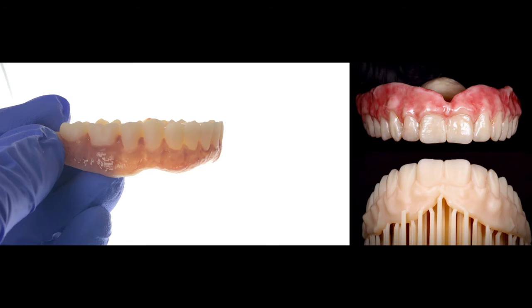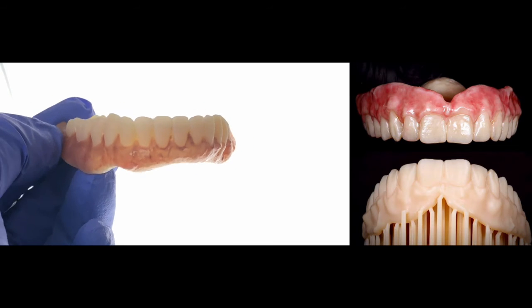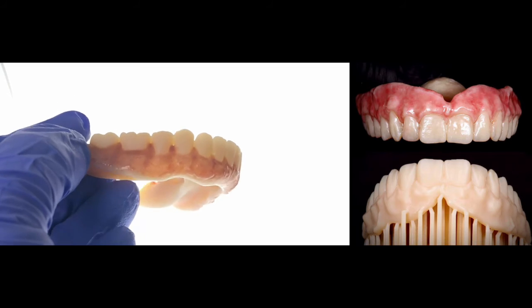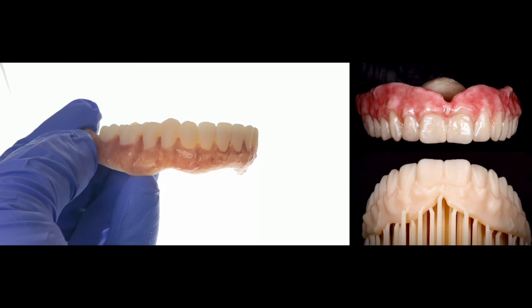In certain cases, you could customize this try-in by painting pink color as is shown on the screen. Stain the try-in denture before the delivery.